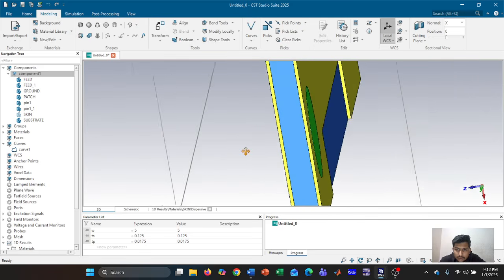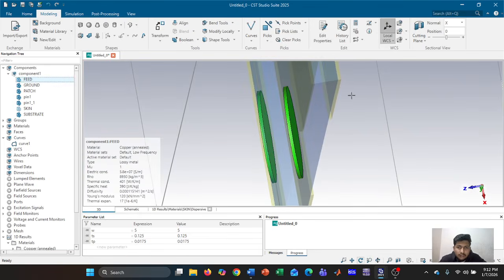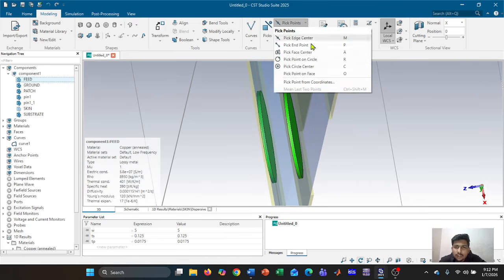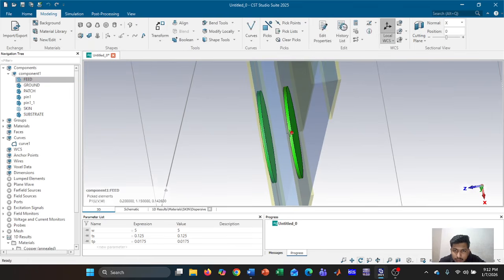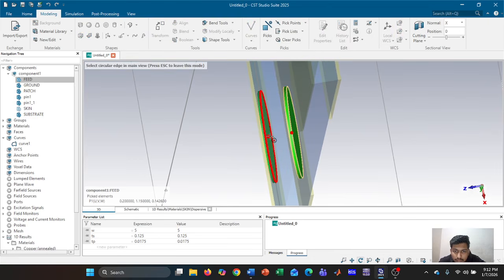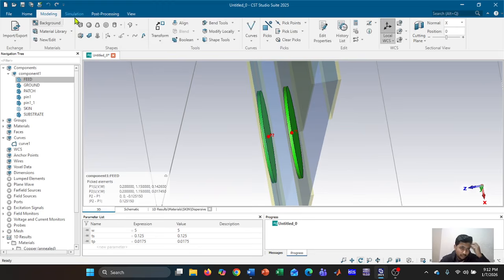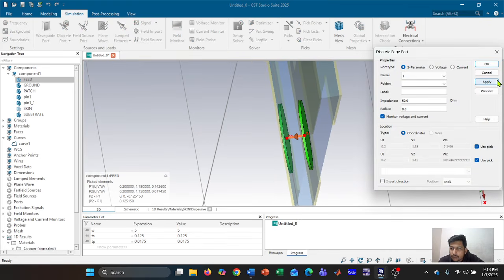Now let me add these two pieces together. Okay, now I need to connect these two pieces with the port point. First select the center to circle this surface, and again pick point on circle. Yes, pick circle center this surface, and go to the simulation, discrete port, impedance is 50 ohms. Okay, apply.